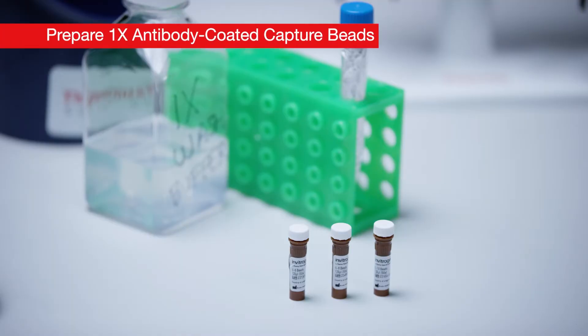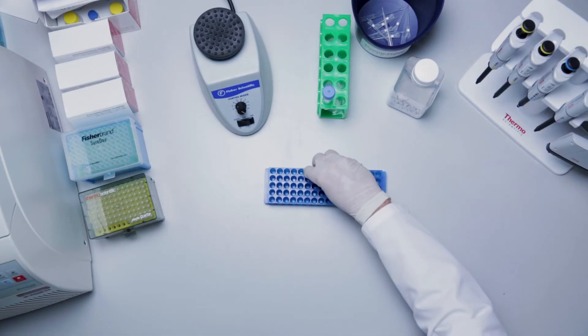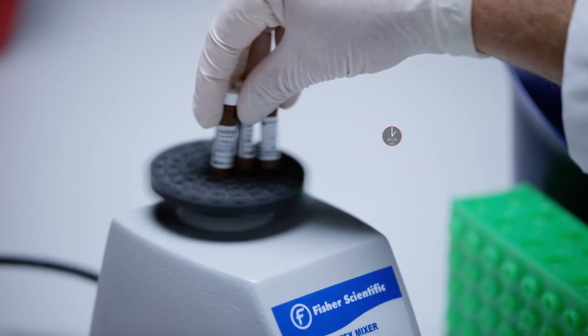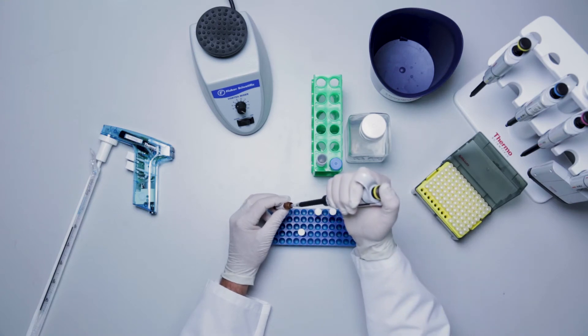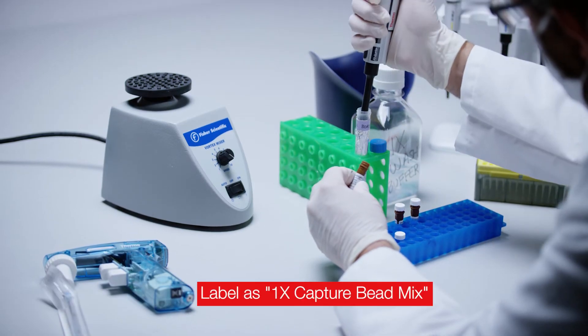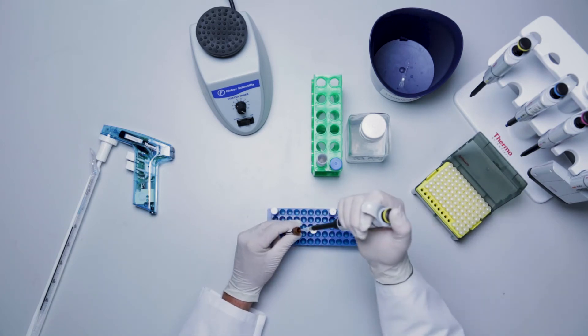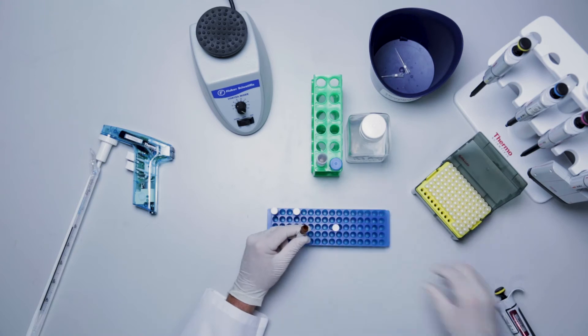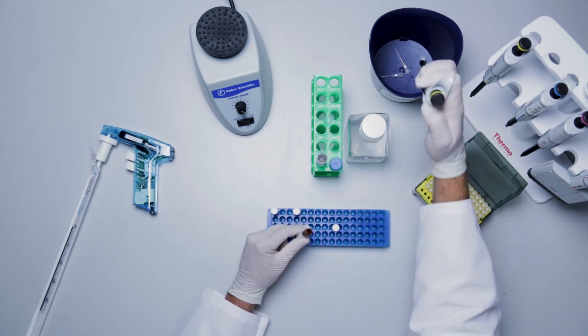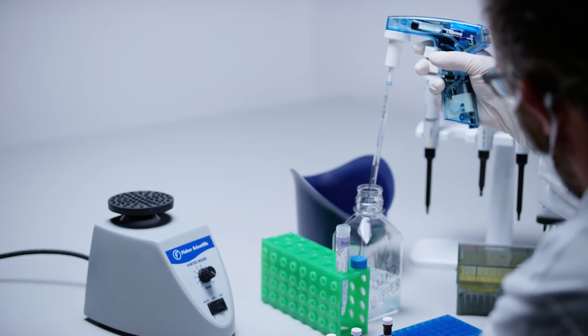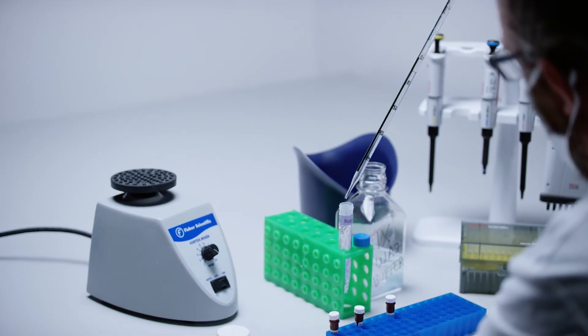Simplex kits are provided with concentrated 50x capture beads. Therefore, dilution is required. Vortex each 50x simplex bead vial at high speed for 30 seconds. Label a 15 milliliter tube as 1x capture bead mix. Add 100 microliters of each 50x simplex bead vial to the 15 milliliter tube if using a whole plate. Otherwise, adjust the volume accordingly. Fill up with 1x wash buffer to a final volume of 5 milliliters.